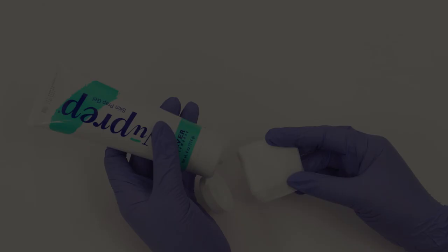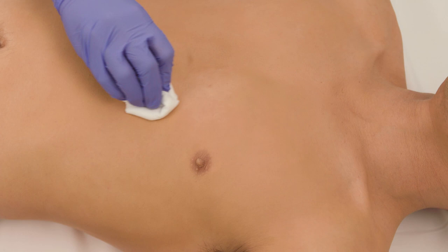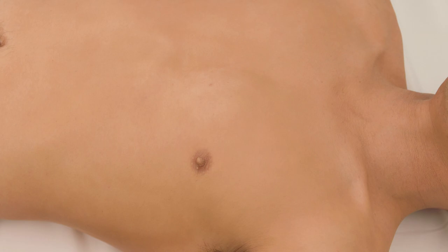After the patient is shaved or trimmed as needed, use the skin prep gel on the areas where the electrodes will be placed and briskly rub the selected sites with the gauze pad. The skin may turn pink. This gel is an exfoliator and removes dead skin cells. Wipe excess after scrubbing.